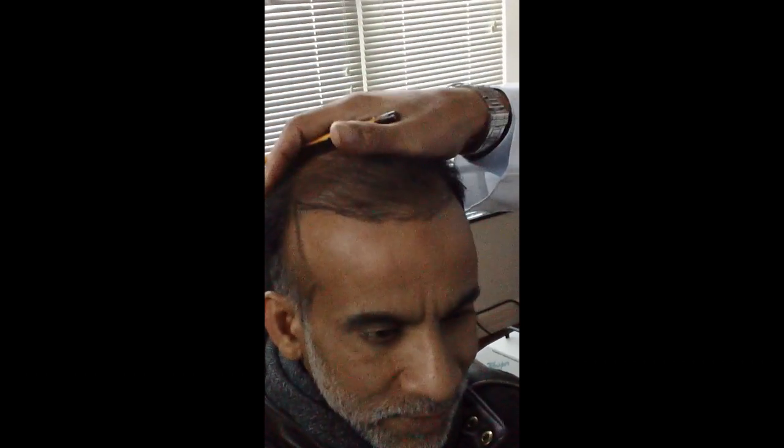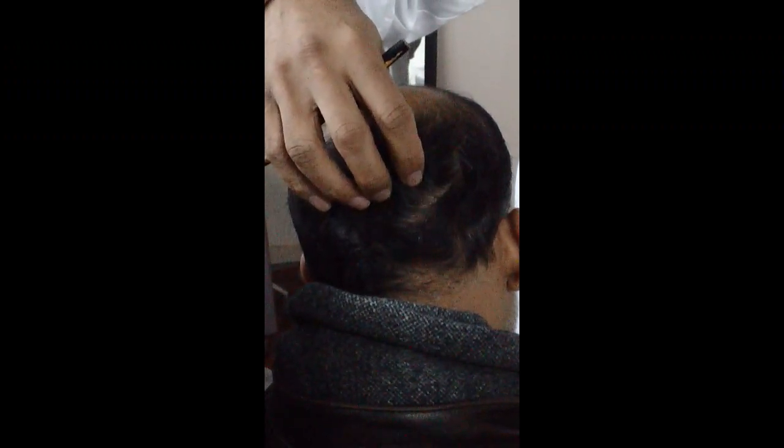And also in the back, if you come around, turn Yaba, the back of his head, as we always do, for 1,000 grafts, we did the ARTAS robotic system. You can't tell, you can't feel, and I always tell patients, because a lot of guys come in here and say, well, you can't see my scar. And I'll say, that's true, but I can feel your scar. What that means is that there's a healing ridge with a big bump of collagen back here that you can feel, but I can feel nothing on him. He could shave his head, no one would know.